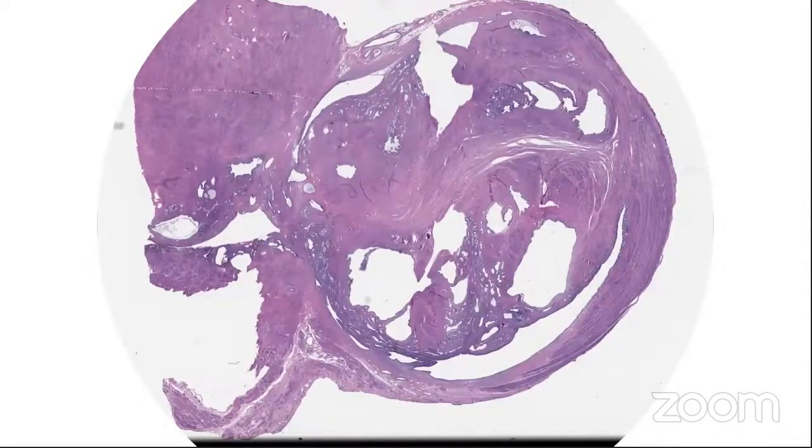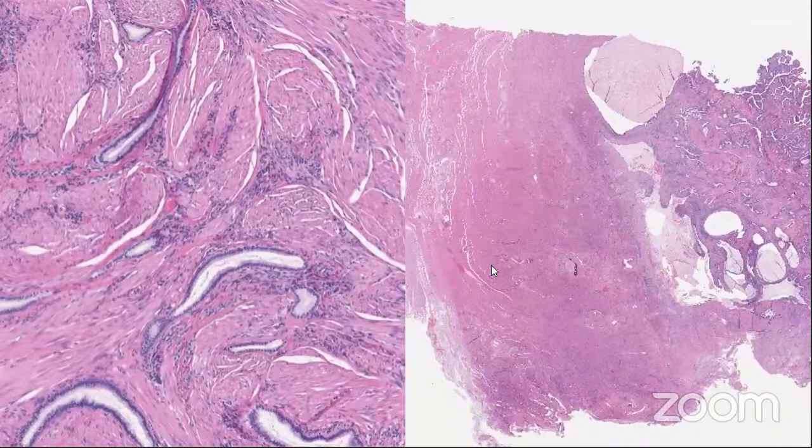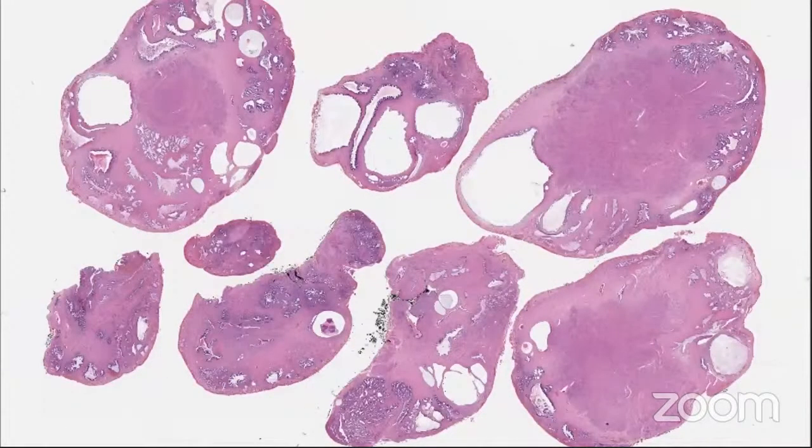So here's an example of a typical cervical adenomyoma. You can see here, this one in particular is very polypoid. You notice the lobular architecture of the glandular proliferation, the intimate admixture of the smooth muscle with the glands here, which are very mucinous in this particular example. You can see, again, another polypoid example here, intimate admixture of muscle and mucinous type endocervical glands. Sometimes they can just be polyps that can be excised. And when you look at them, they look like polyps, but in fact, they have this expansile smooth muscle, which you don't typically see in the cervix. But again, on low power, you can see that lobular configuration of mucinous type epithelium.